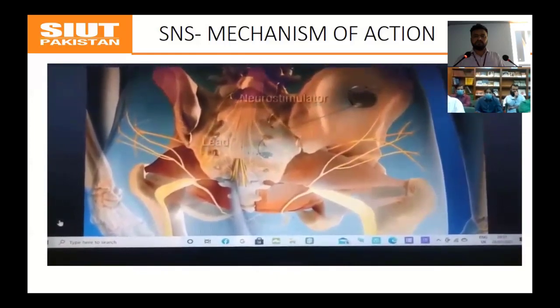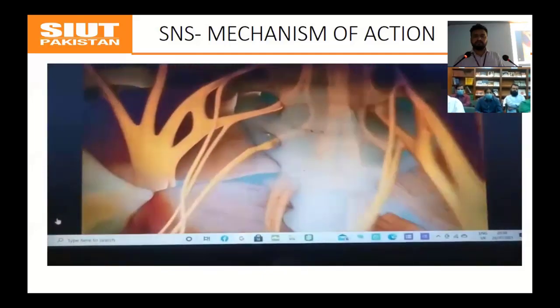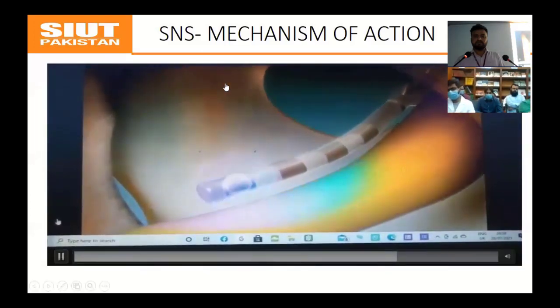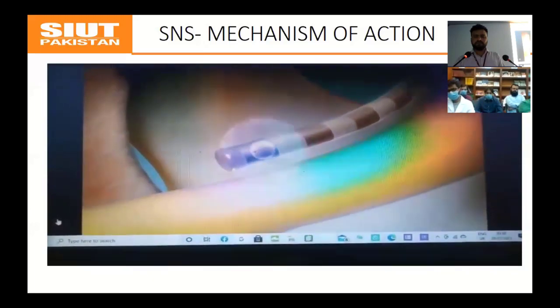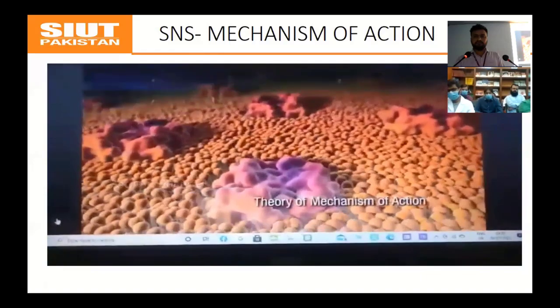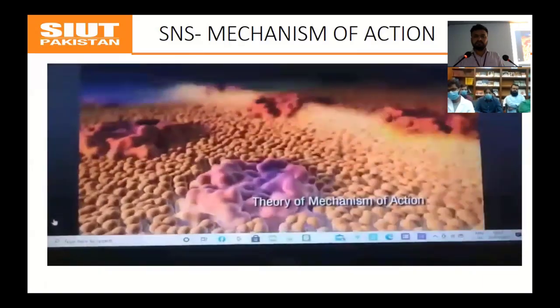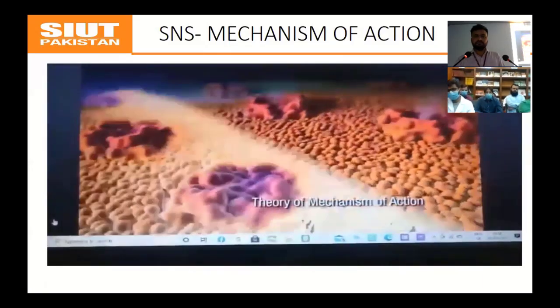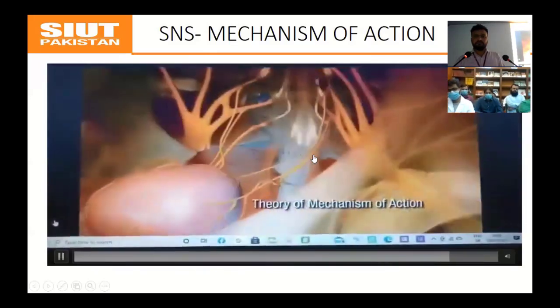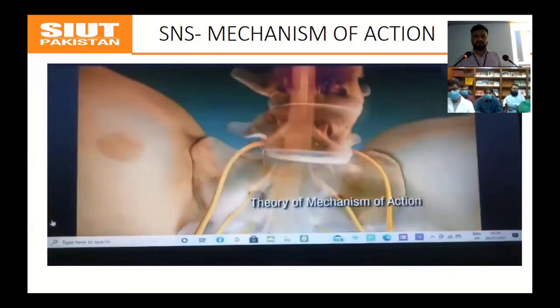Medtronic sacral neuromodulation delivers electrical stimulation to a sacral nerve via an implanted neurostimulator. The neurostimulator provides an electrical charge to an area near the sacral nerve, resulting in altered neural activity. This stimulation likely depolarizes the nerve, causing an action potential that propagates impulses along the axon as if the neuron naturally fired an action potential. As a result, it is thought that abnormal sensory input from the bladder is modulated.